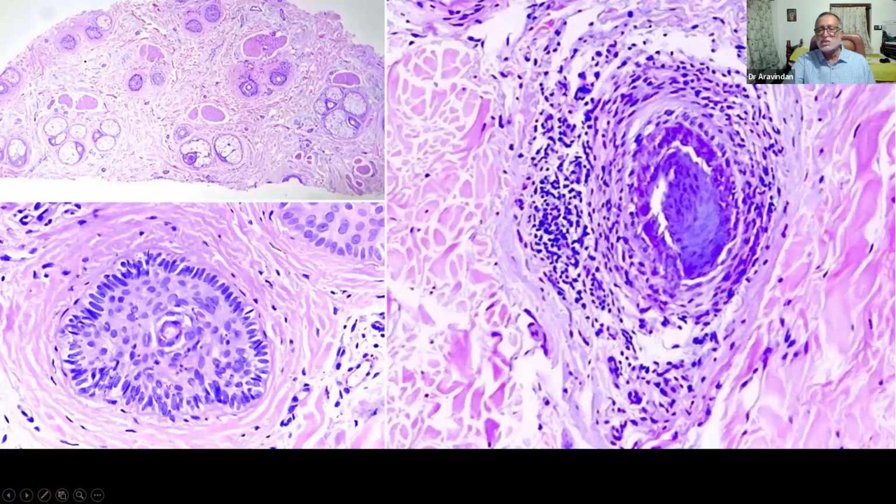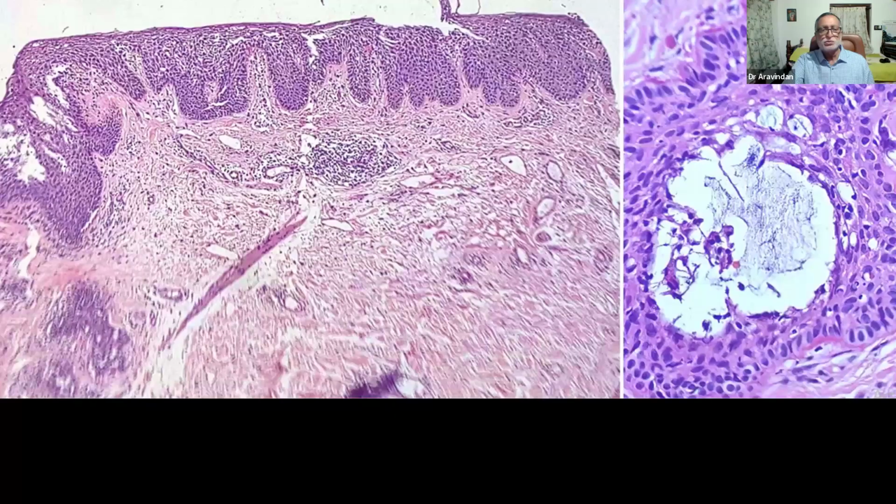And in this case, there is no scarring. Plenty of follicles are there, no scars are found. And you find more of telogen and less of anagen follicles, more of the telogen and catagen follicles, and inflammation. Inflammation all around, and sometimes it will be likened to a swarm of bees. And this is a typical appearance of alopecia areata, a case of non-scarring alopecia.